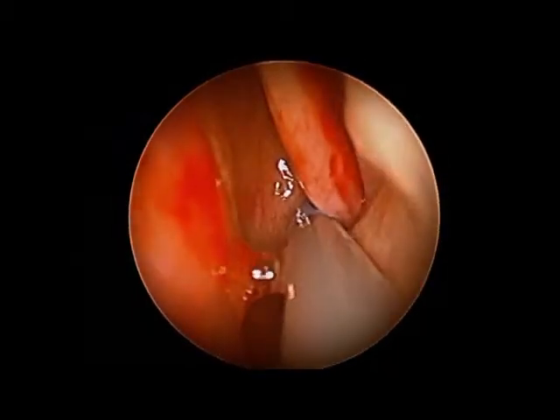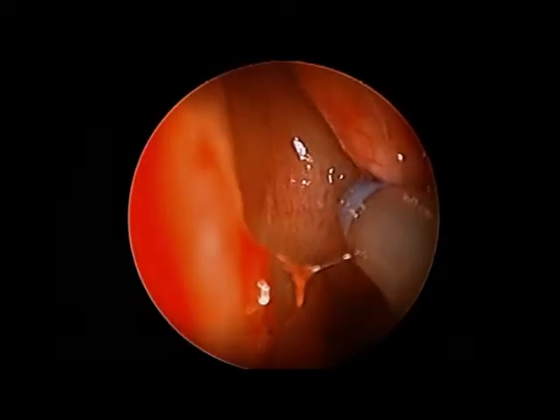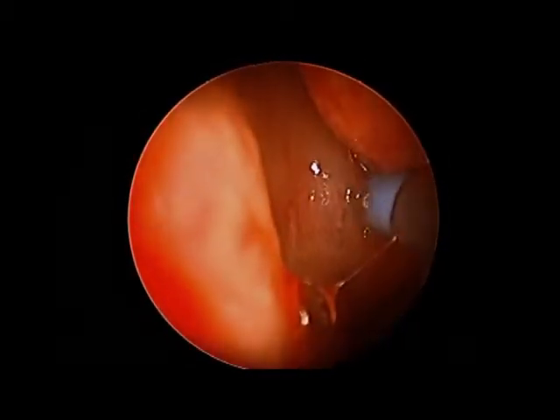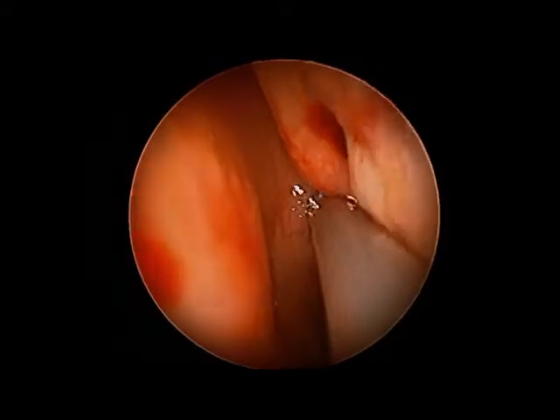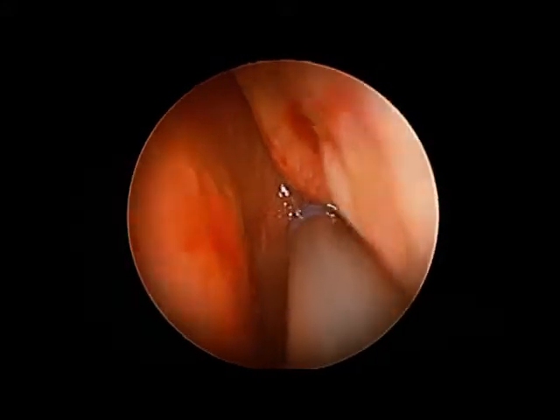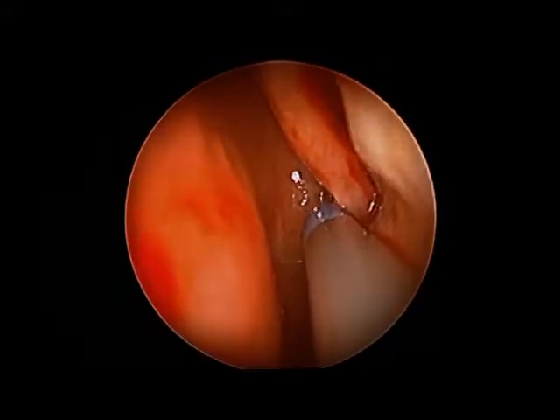Here you can see the guide catheter passed in the left nasal cavity, medial to the middle turbinate and superior turbinate.